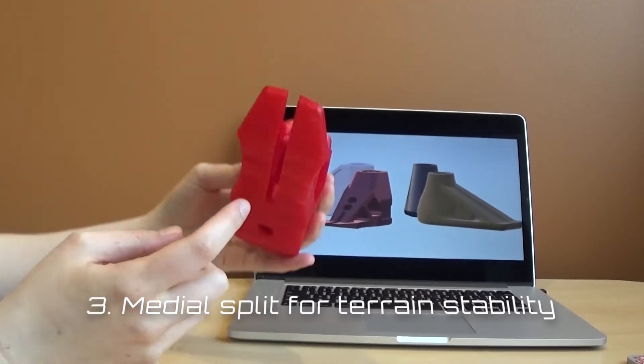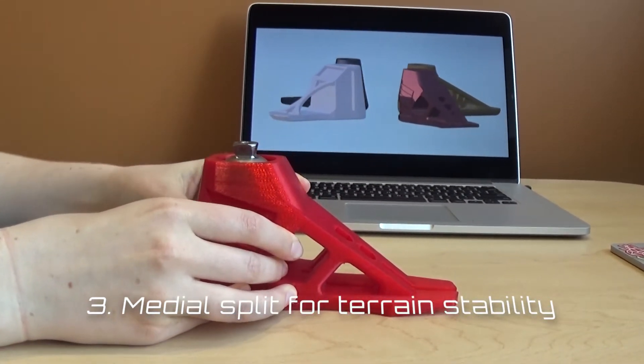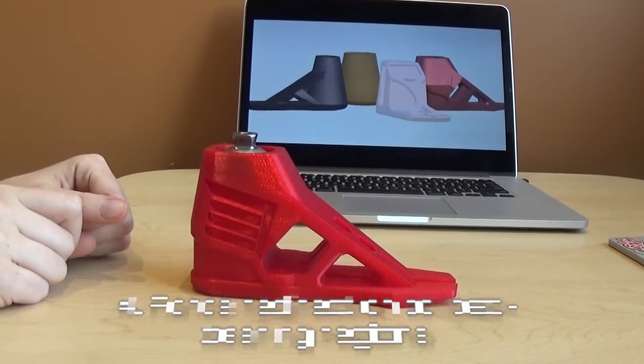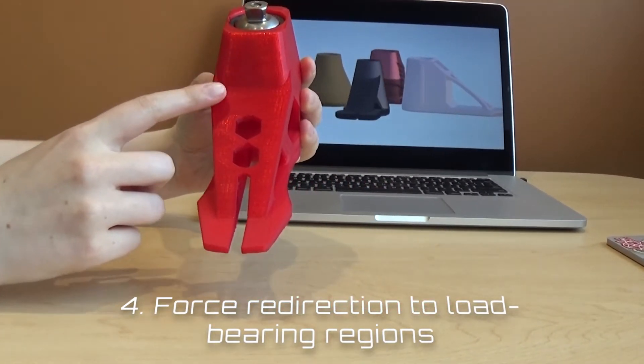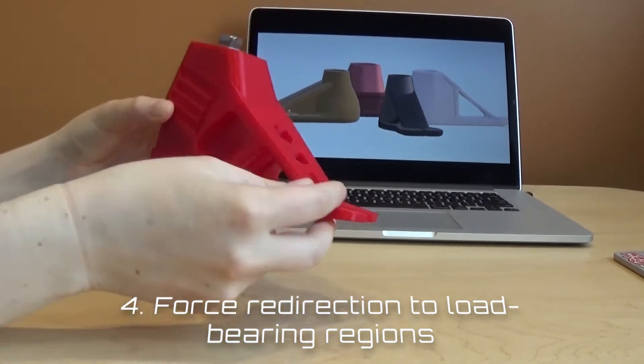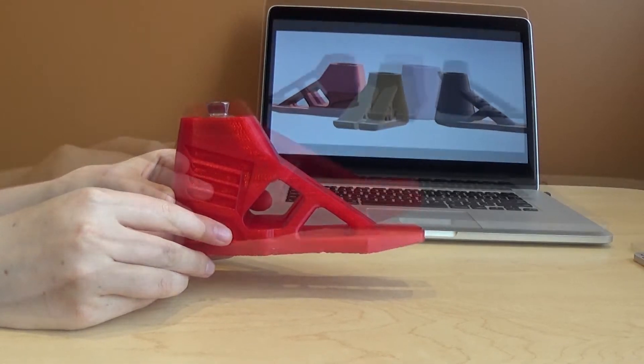Third, a medial split in the keel allows for necessary deflection when the child walks on uneven terrain. Fourth, when ground reaction forces reach their second peak during the terminal stance, the bridge-like structures along the dorsal surface of the keel redistribute the forces back into the heel of the prosthesis.